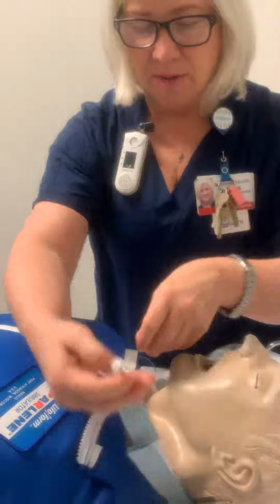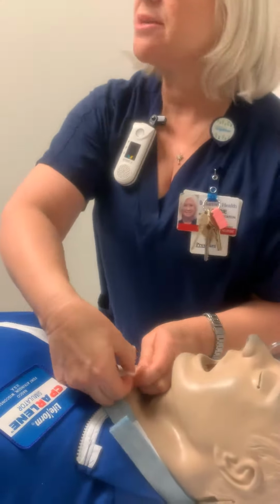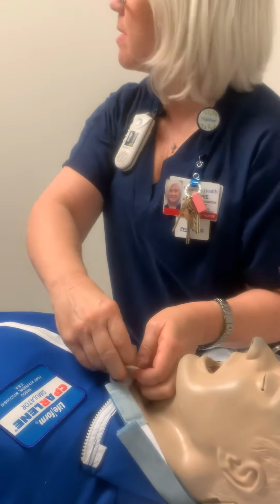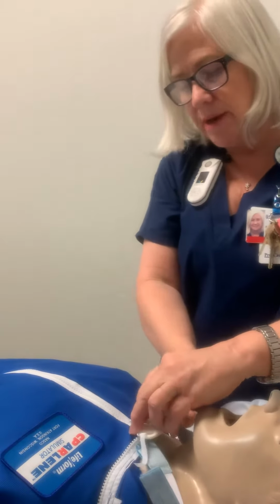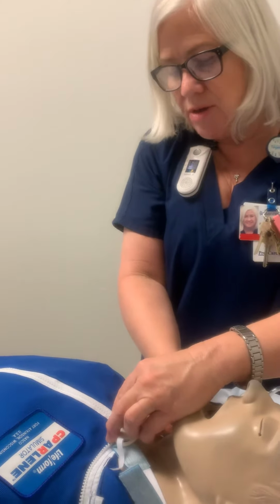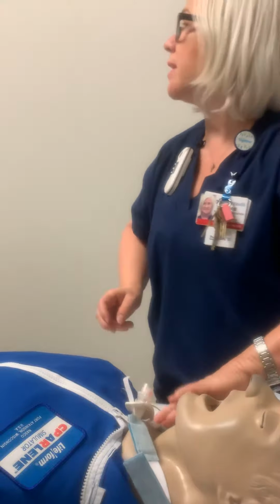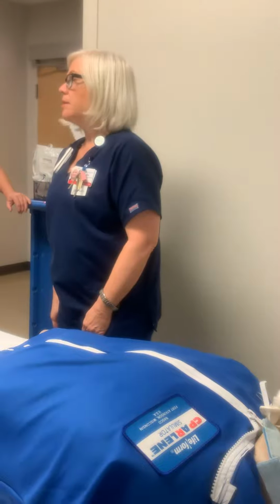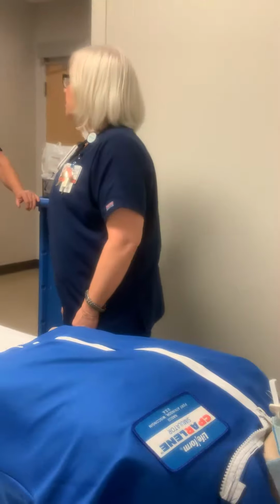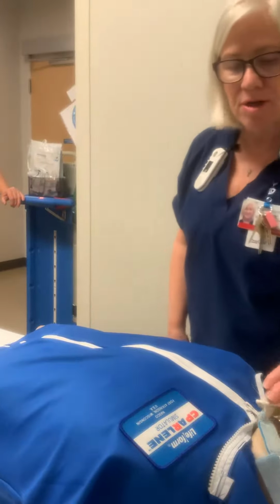Okay? So, now let's say my third altered airway, I have a partial laryngectomy. They'll do that because maybe there's strictures, maybe cancer they've had to remove, but my larynx is still intact. But my trach falls out. What am I gonna do? Where can I ventilate? It's a partial laryngectomy. You're recovering this patient. They have a trach tube in, but the trach falls out and they're a partial laryngectomy.